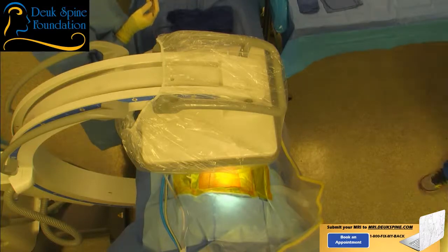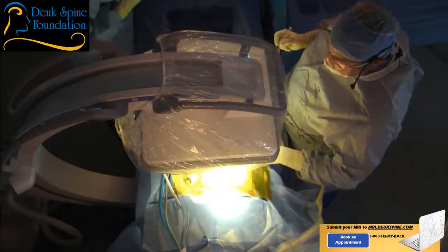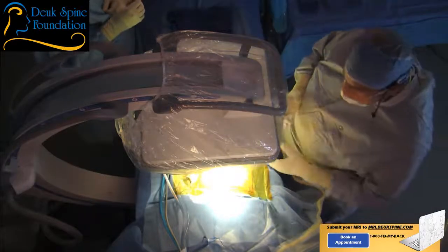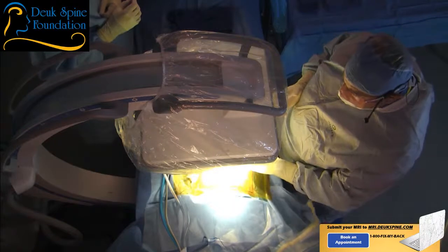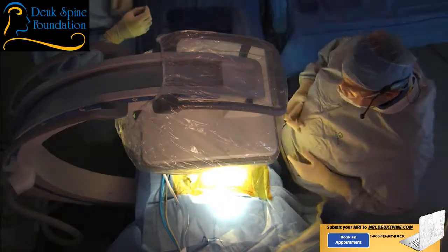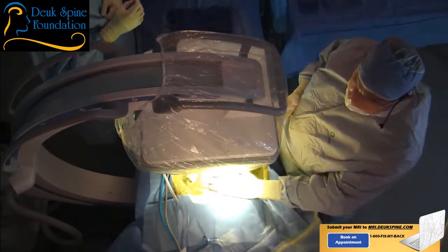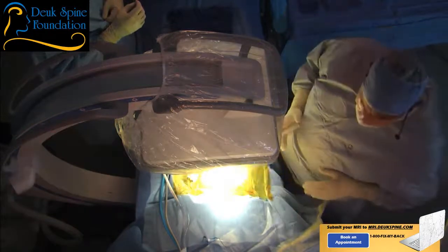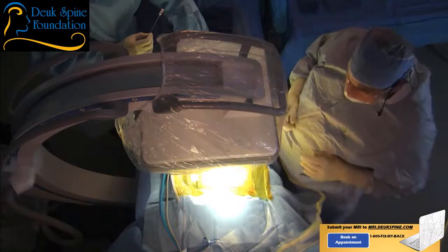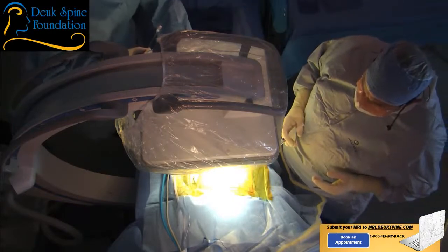Our patient has a herniated disc at L4-5. Good morning, it's Dr. Duke Majin. I'm going to give you some numbing medicine right here in your back to help make it more comfortable, but you're going to feel a little stick and burn. It's going to last a few seconds. If you feel any discomfort during the surgery, I want you to say 'ouch' — but don't try to get off the table.